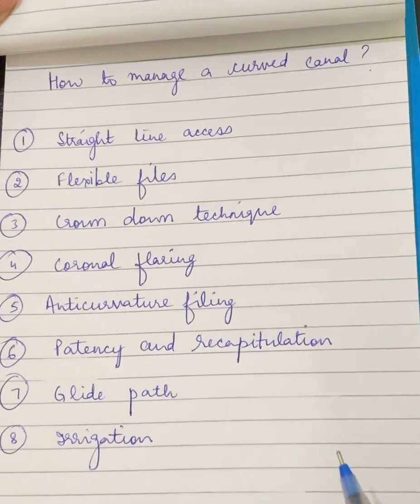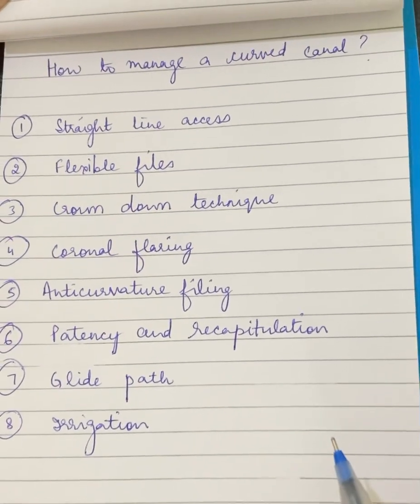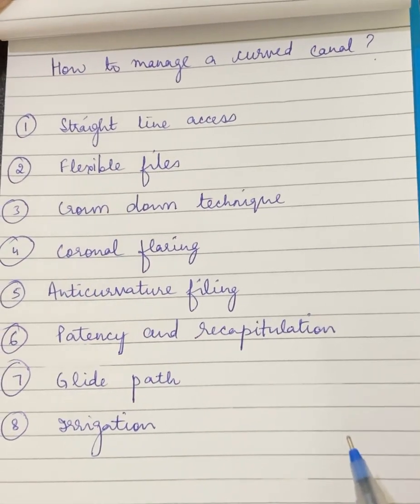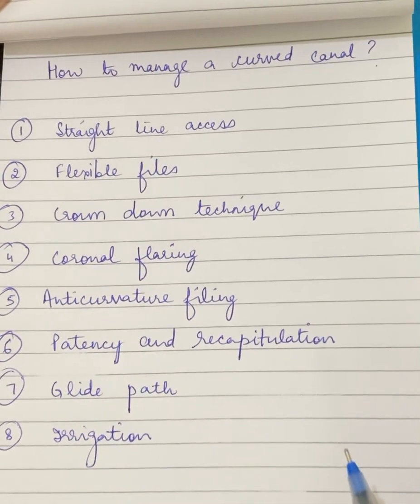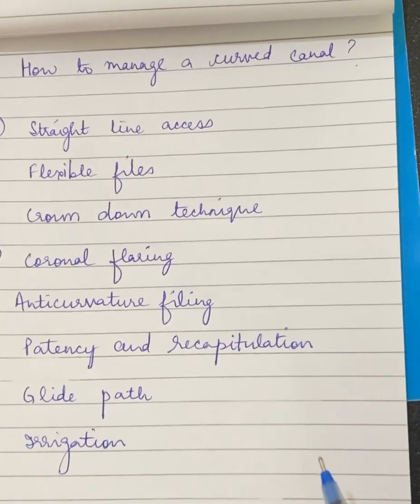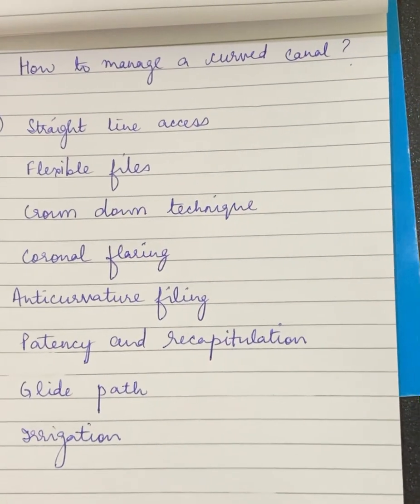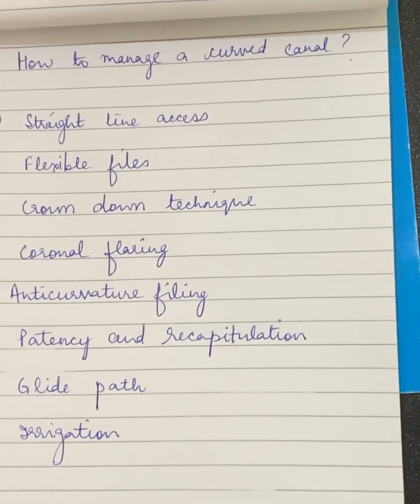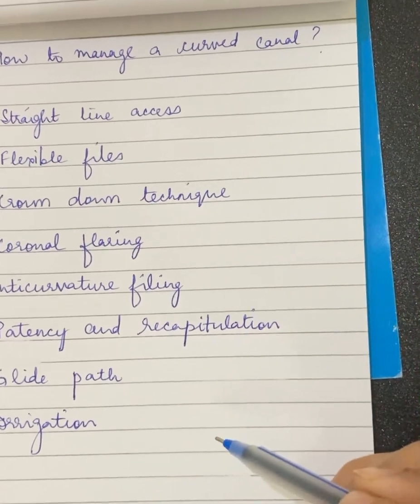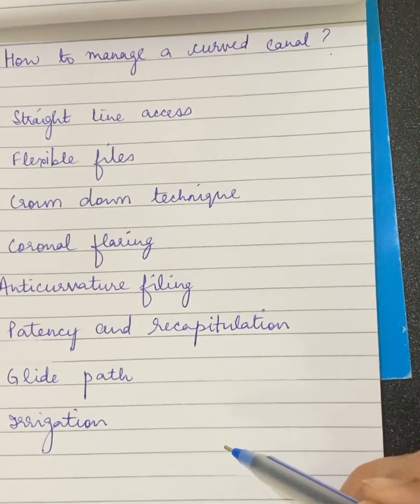Hello friends, today we'll learn how to manage a curved canal. Curved canals can be a very difficult problem for an endodontist and a general dentist because they pose a difficult challenge to all of us. So there are a few basic steps that we should all know in managing a curved canal. I'll be discussing a step-by-step approach. Basically there are 8 steps involved.